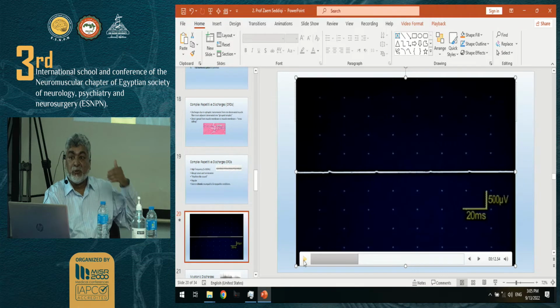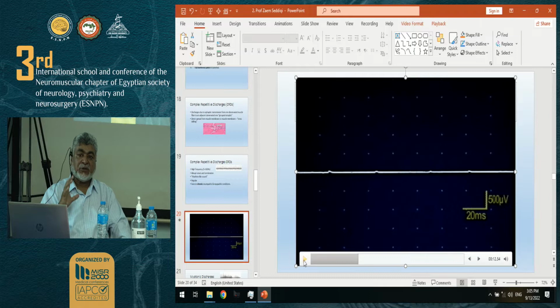Very common in chronic radiculopathy, paraspinal muscles. You see them all the time. In chronic radiculopathies, they are very common in paraspinal muscles. Okay, CRDs. Many other conditions. There are certain myopathic and neuropathic also. CRDs, hallmark of chronic neurogenic activity. Okay. And they have muscle fibers who are talking to each other, cross-talking with reinnervation.